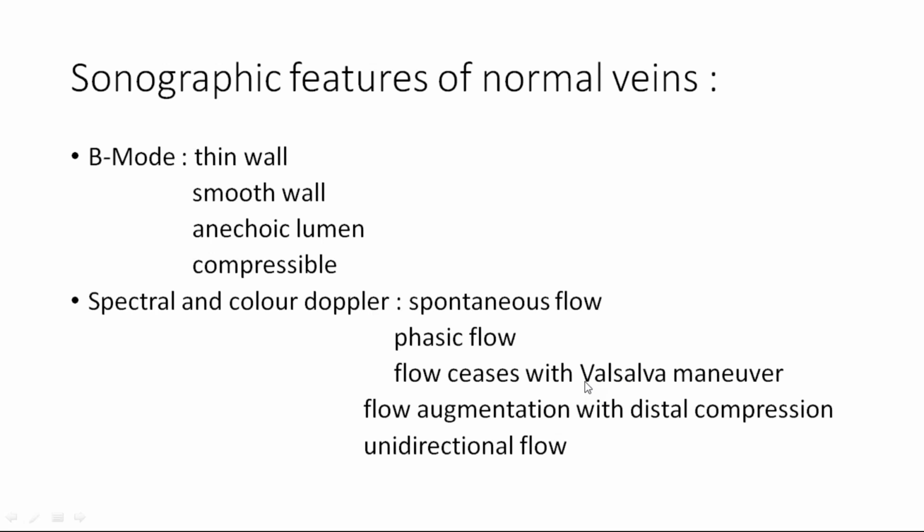We assess the phasic flow with the Valsalva maneuver, and we can see flow augmentation, which means an increase in the flow in the distal region when the limb is compressed with ultrasound. It is unidirectional flow. Unidirectional flow is seen in veins.